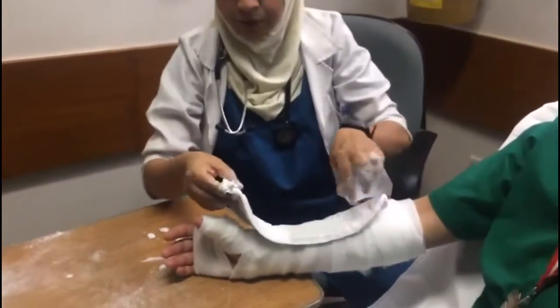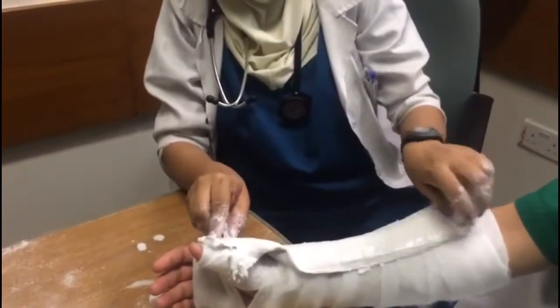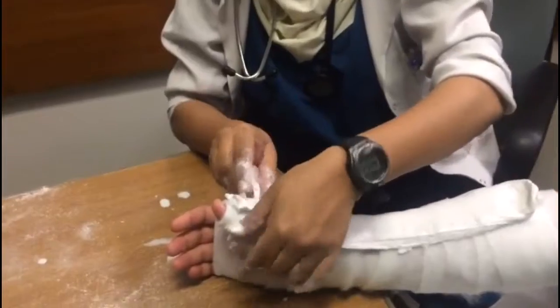Let it rest to allow the plaster to set for five to ten minutes. I like to tear my splint into three sections, forming a W shape.